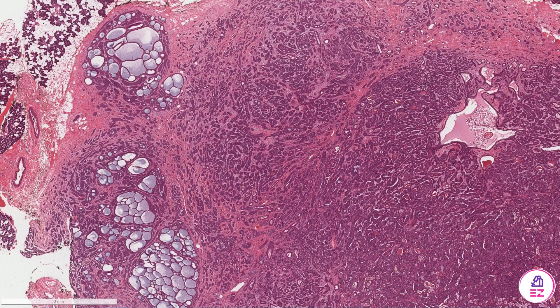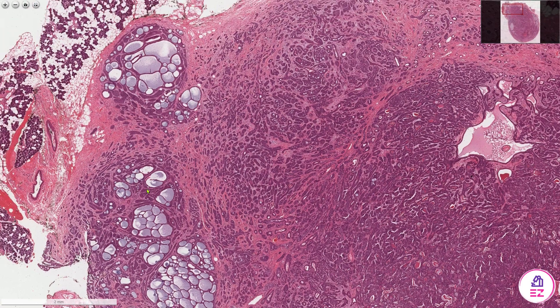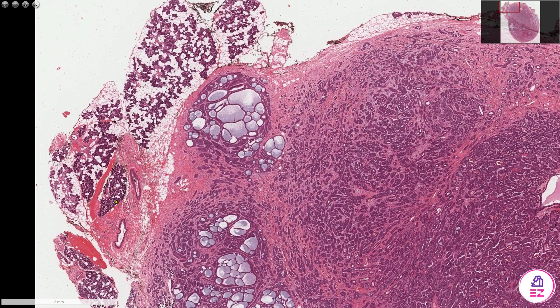Hello and welcome to Path Made Easy. Today's example is an adenoid cystic carcinoma. The tumour is encompassing much of the image on screen. Over in the top left, we do have some normal parotid parenchyma.